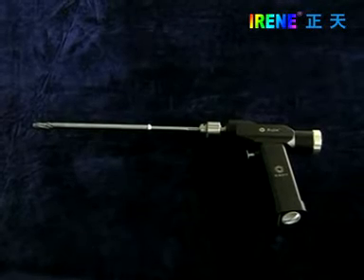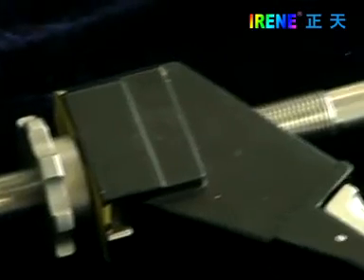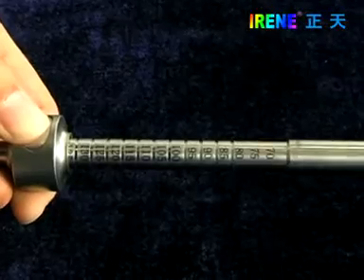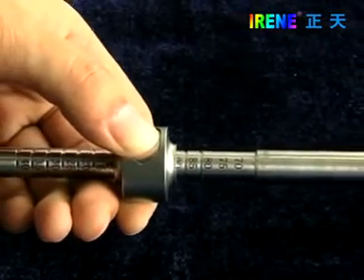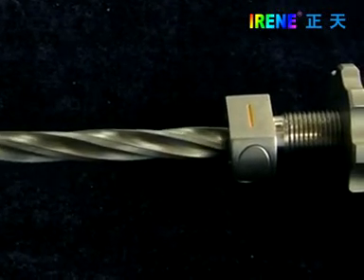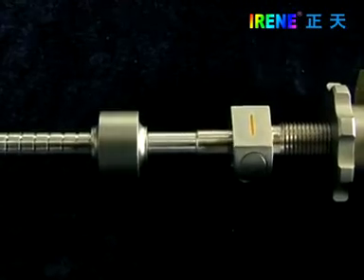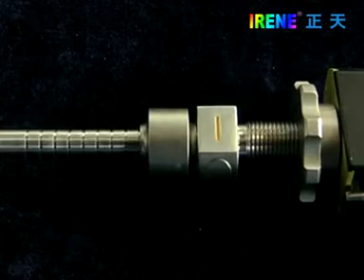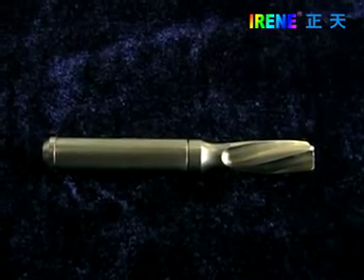Insert the cannulated drill using the power tool and only open the first cortex. Then adjust the limiting device to 80 mm, the same length as the blade screw. Drill further until the limiting device touches the protection sleeve. Take out the drill and the pin.